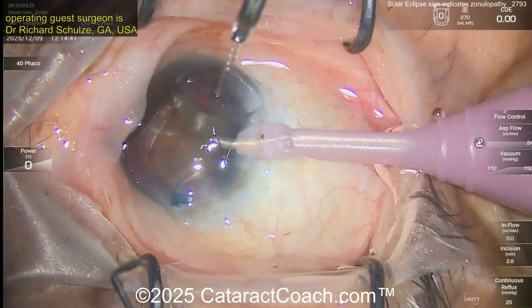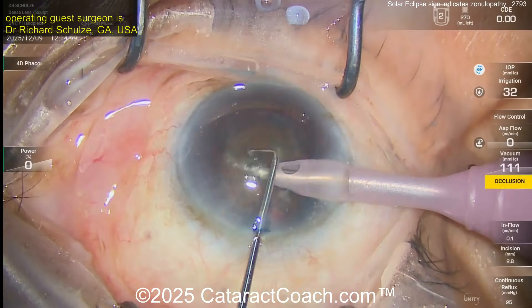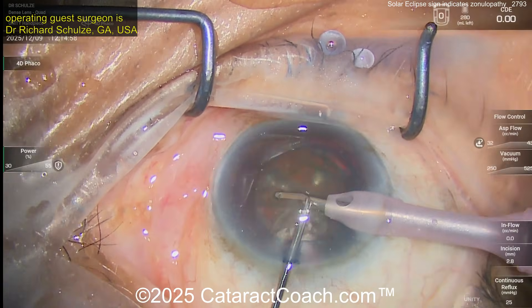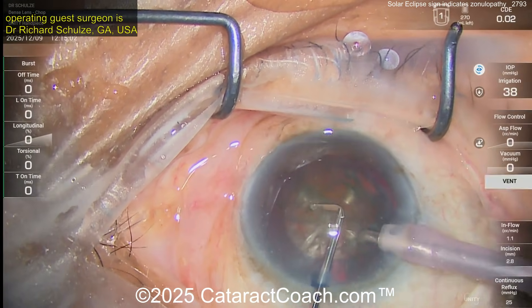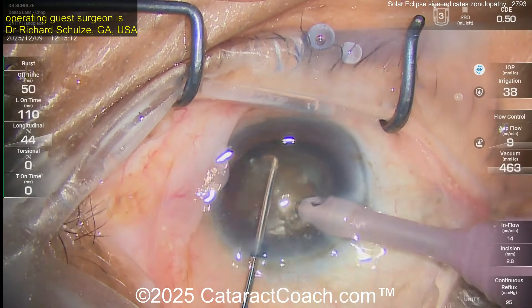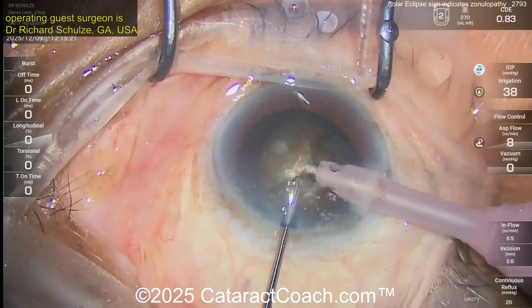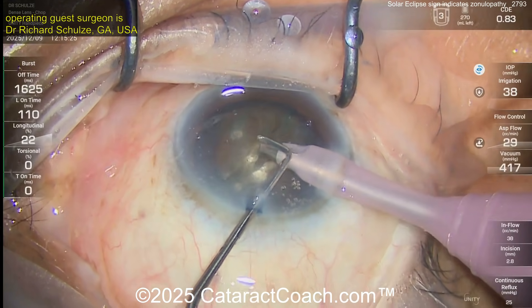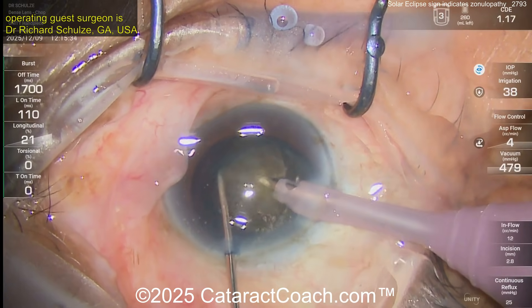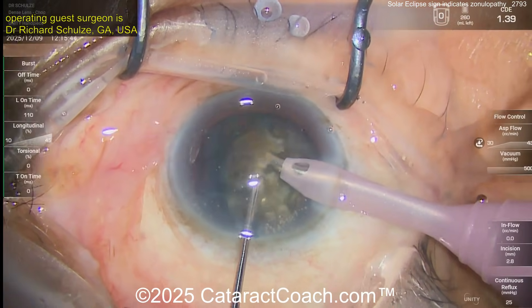The chopper is in the left hand. This surgeon is sitting superiorly — obviously anything works, whatever's comfortable. Going to occlude and do a chop — looks like a horizontal chopper, Nagahara style. The phaco probe buzzes the nucleus, the chopper goes around the lens capsular bag equator, around the edge of the nucleus within the capsular bag, then buzzes the nucleus again. The chopper goes around the nucleus equator — boom — the entire time the chopper is inside the capsular bag.